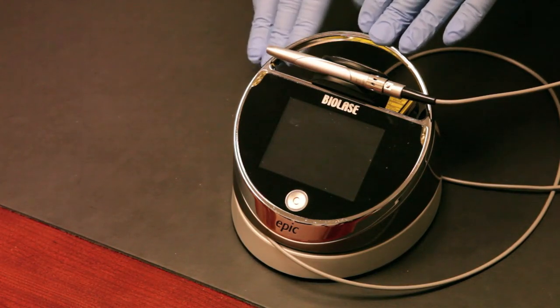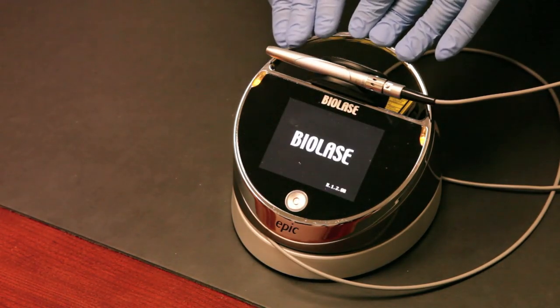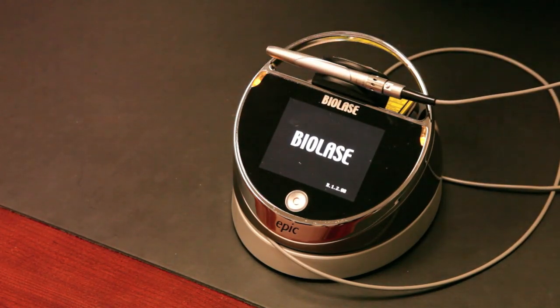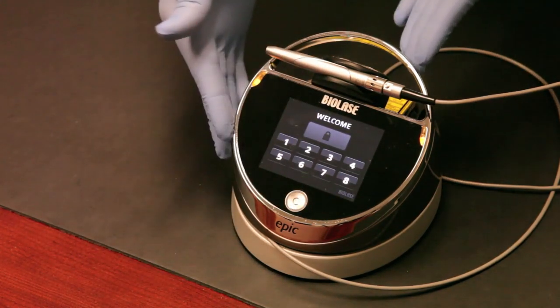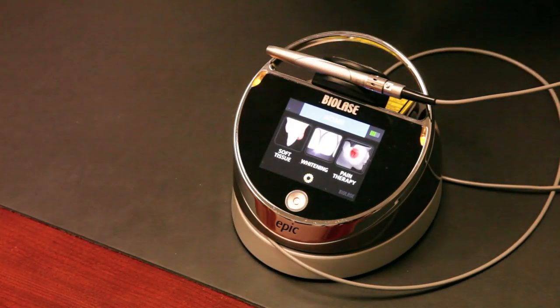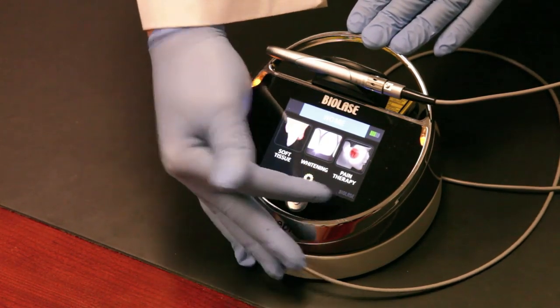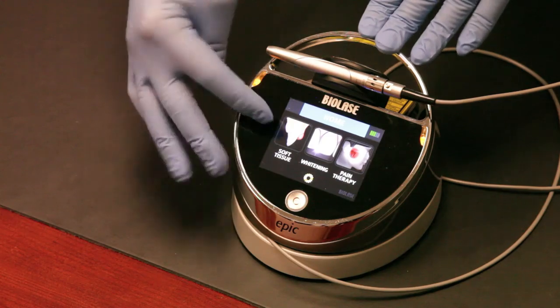Our next step is to look at the user interface. We'll power the laser on and walk through some of the UI commands — you'll see how elegant and simple it is for clinical use. You get a welcome screen, simply touch it, enter the password which is 888 for every EPIC, and there's your user interface. You have three treatment centers: soft tissue, whitening, and pain therapy.